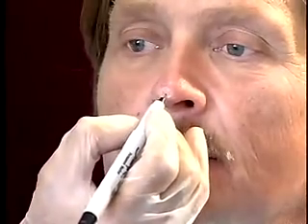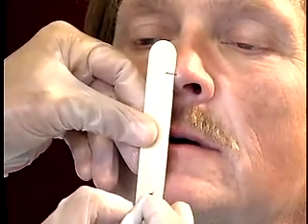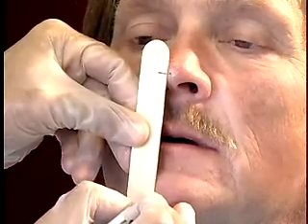Mark a small dot on the nose and the chin to serve as reference points. Ask the patient to say "Emma" several times and relax his jaw, or swallow and relax his jaw several times. Use a tongue depressor blade to record the distance between the reference points when the patient's jaws are in the physiologic rest position. This measurement on the tongue blade is the vertical dimension of rest. It should be relatively constant after several repetitions.